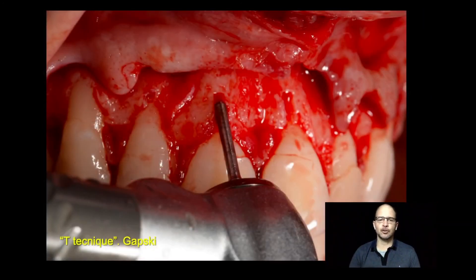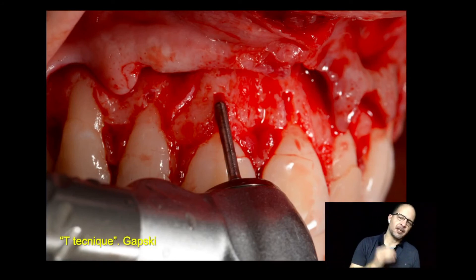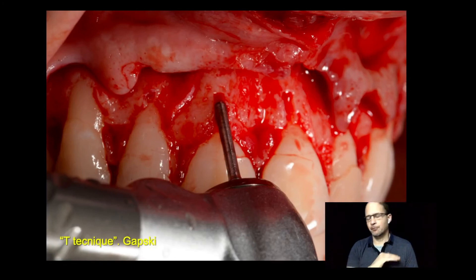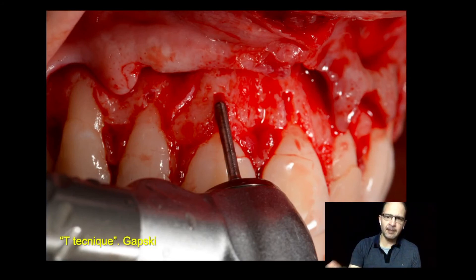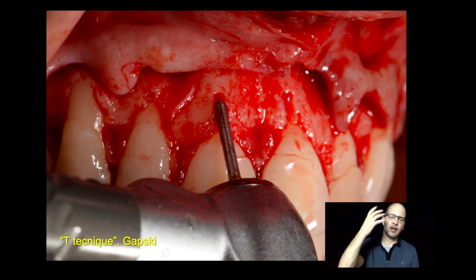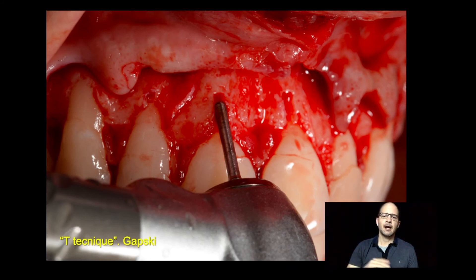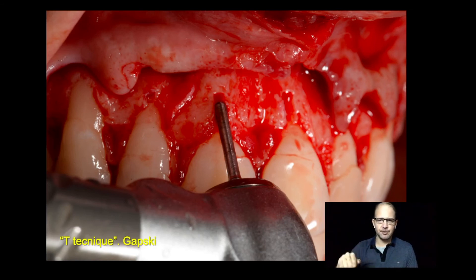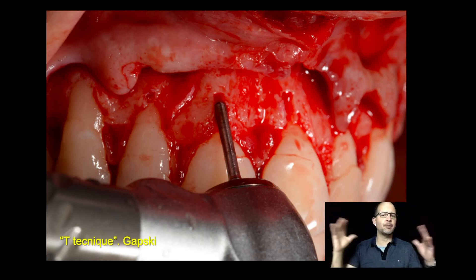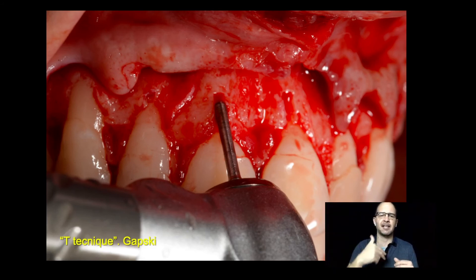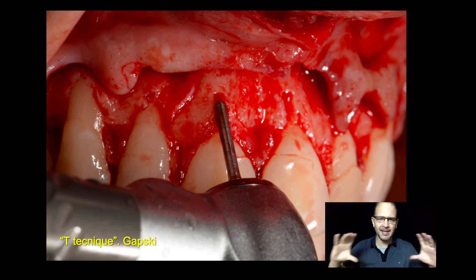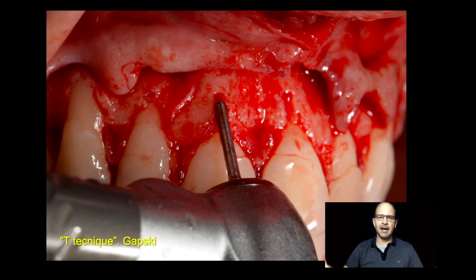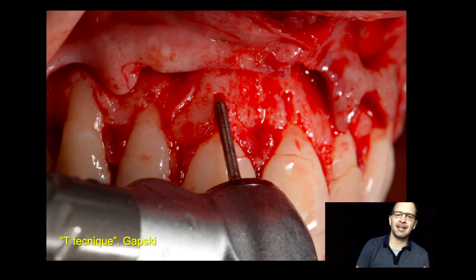Finally, I just want to show how I do my crown lengthening. First, I use the proportional gauge — tooth well indicated, without tooth abrasion, not a skeletal patient. I perform my incisions. After that, once everything is perfect, I don't open the incisions to do touch-ups later — it's difficult. When I see that the gingival smile is perfect, I use my T-technique.